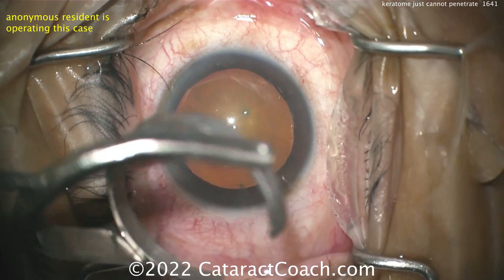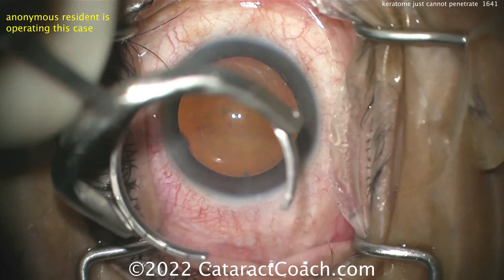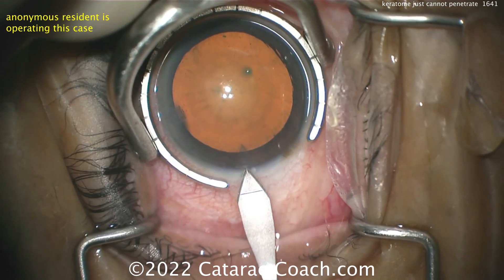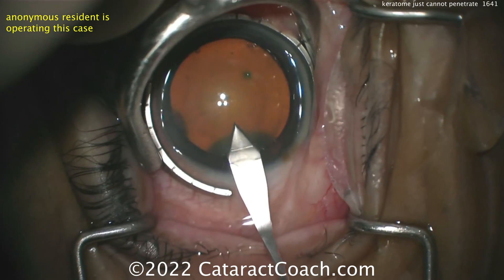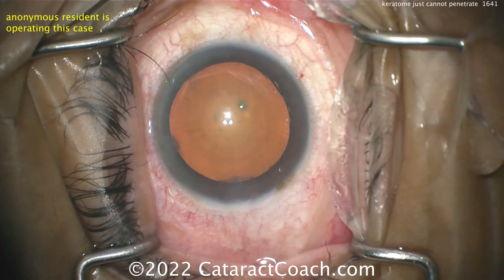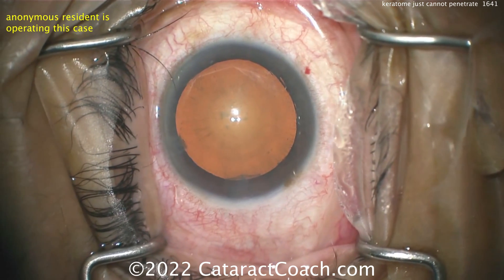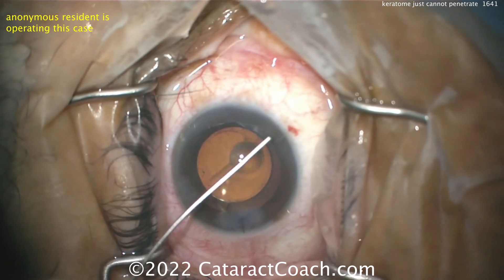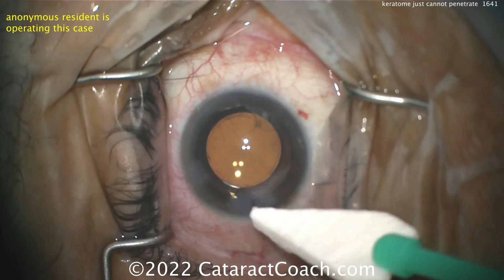Fixation ring going down again, and now hopefully a new keratome. You want to be in that same tunnel, that same initial path that you created — you don't want to be making a new path. The fixation ring's a little too close to the keratome blade, by the way; you want to have that keratome centered between the opening. And look at that — it goes in so easy. What a difference. If you have this situation where the blade just doesn't want to go in the eye, think carefully — it could be a very dull blade or the tip has been damaged. At the end of the case, everything looks great. I like the idea of putting a suture in because you're a young resident, you're still learning. Plus, that incision's been through a lot and may not seal as well, so the suture's helpful.